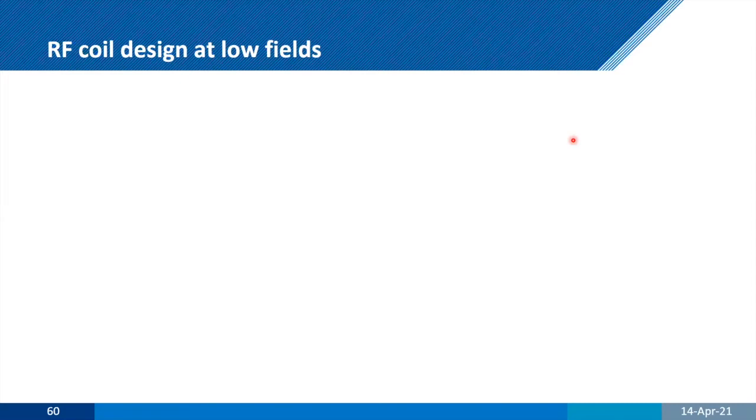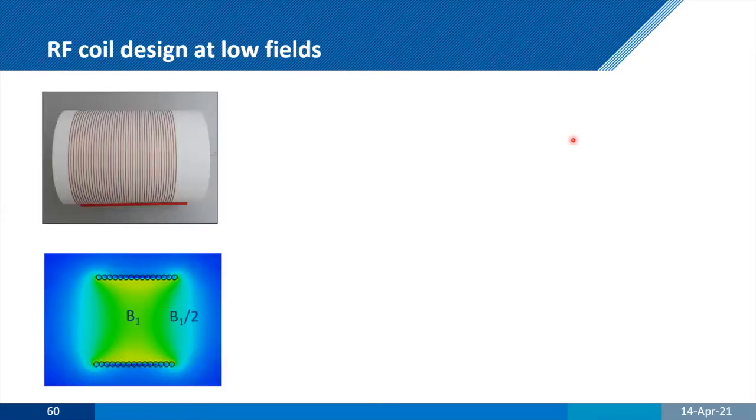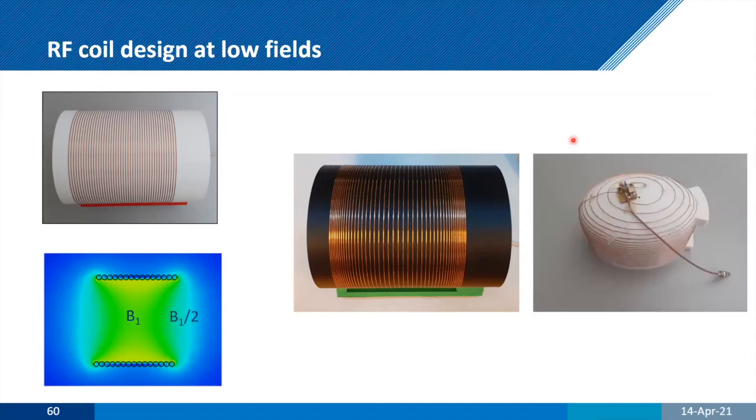And RF coils are fairly simple, right? Solenoid is what you want. It's highly sensitive. It's got a pretty uniform B1 field. We can improve that B1 field by having the wires slightly closer together on the outside and slightly less close together on the inside. And of course, we've also decided to steal the design coming from Matt's and Charlotte's lab. And for most of the brain studies, we use this spirals version of the solenoid. And this really helps, of course, with signal at the top of the head here.